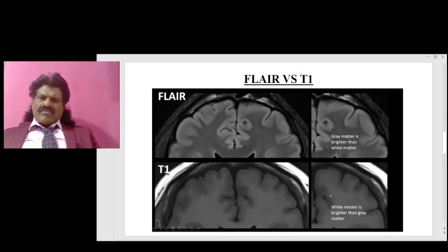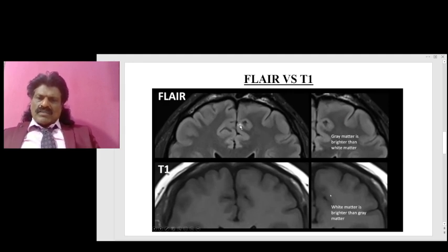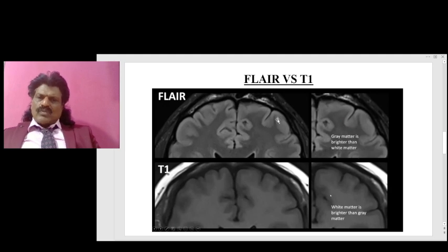How do we differentiate FLAIR versus T1? In both sequences, the CSF appears black. On T1, the normal color code applies: gray matter is gray or dark and white matter is white or bright. But in FLAIR, though the CSF is dark, the gray matter appears white and the white matter appears black, because FLAIR is actually a T2 sequence with CSF signal suppressed.